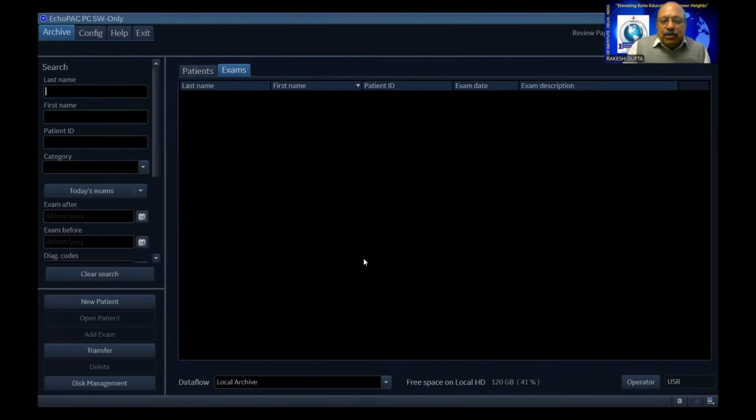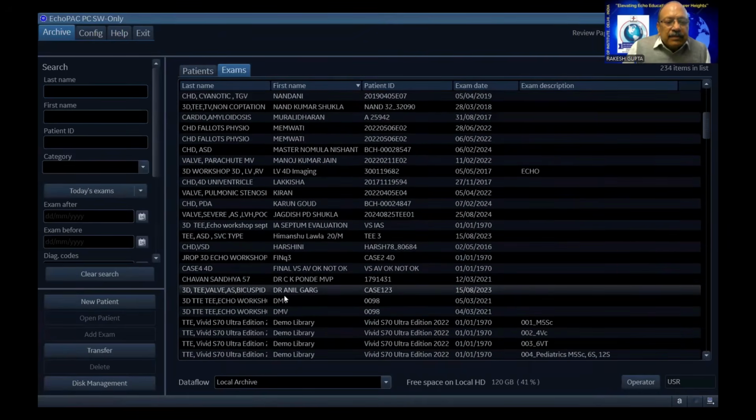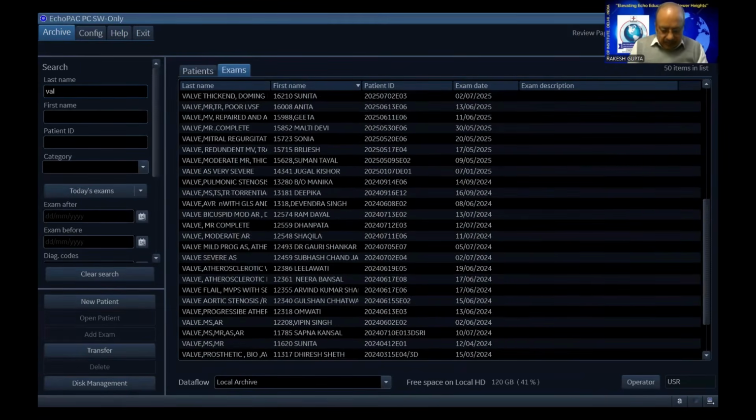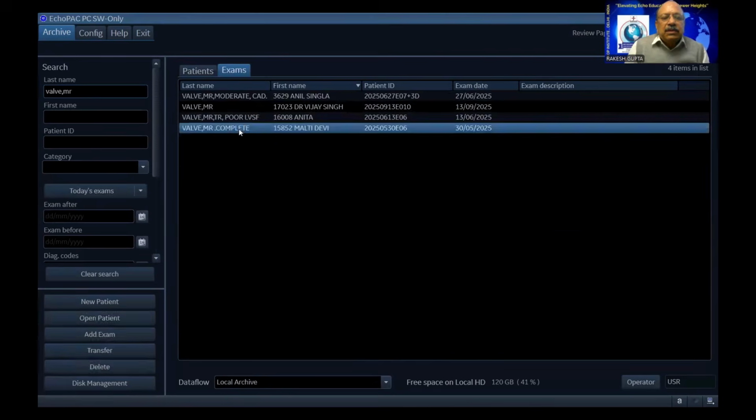I should be able to show you the vena contracta right now.